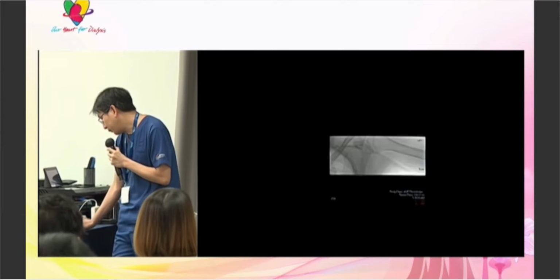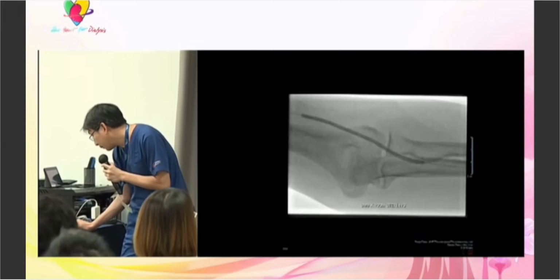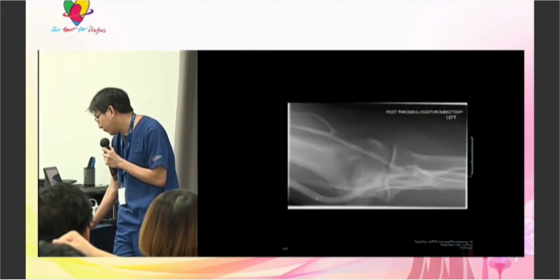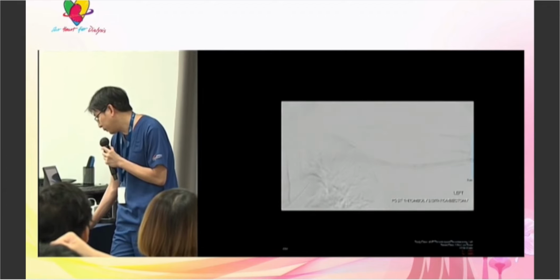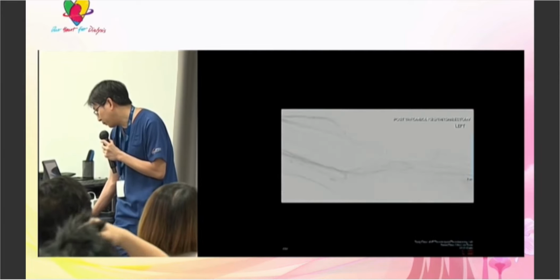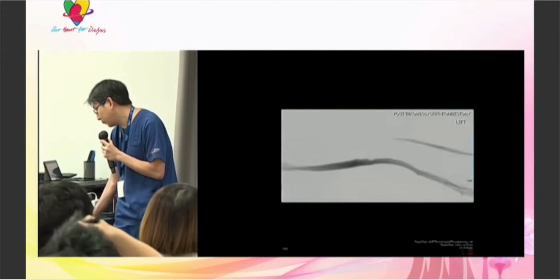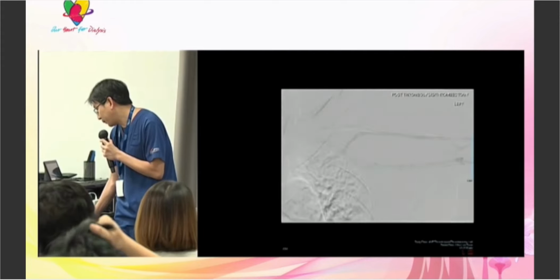I think I used the urokinase to lyse and then plastied it after that. Got a flow channel going, got it looking fairly decent this time. Perforator and anastomosis were all right at this point because I already treated them previously. And that's it. Just use the 5 mm balloon across. So I basically tried to mature the entire outflow again, and it looked pretty decent in the final pictures. I think I used a 6 after that, and it looked really nice. But that's also something different.